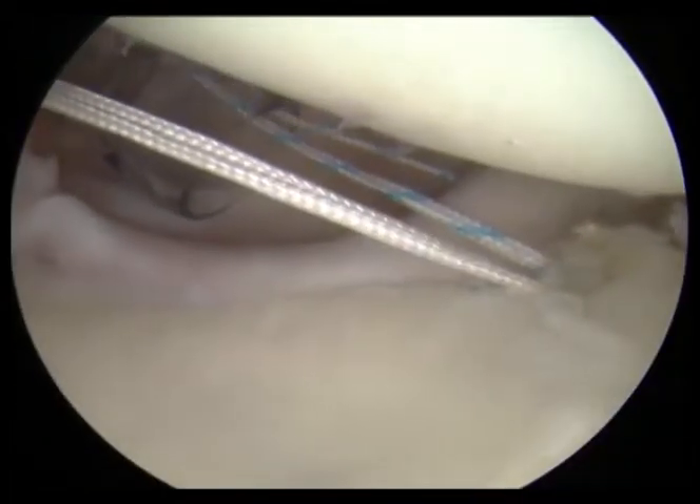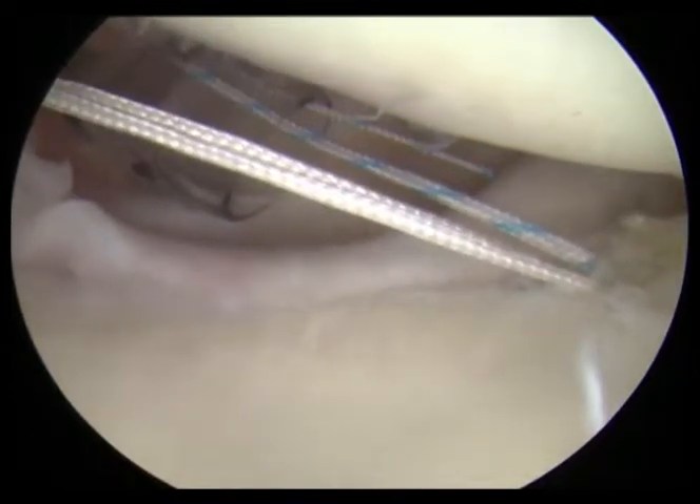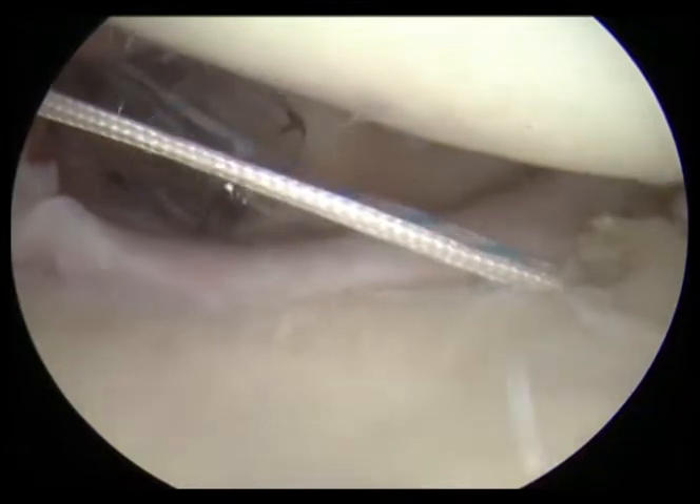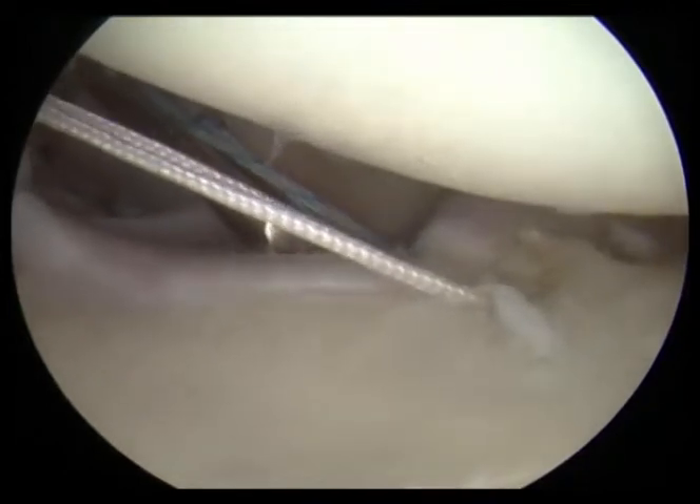This is where we start to place our suture anchors into the bone, and we're passing the suture — you can see the different colored suture — through the labrum. This is going to allow us to bring that soft tissue labrum, which creates a suction effect to hold the ball in, back up to the bone.